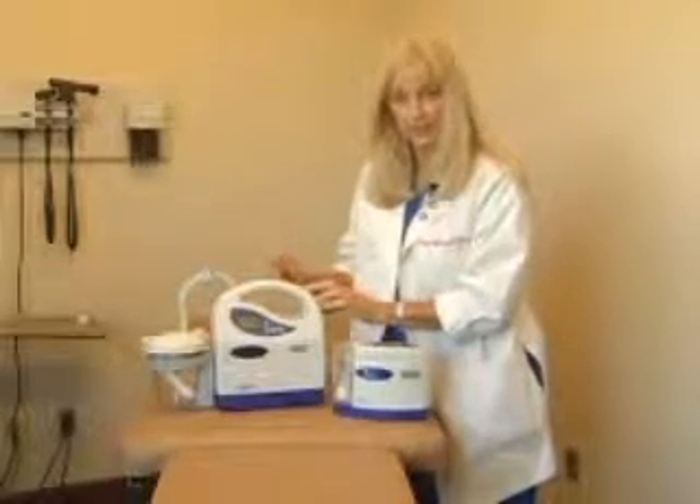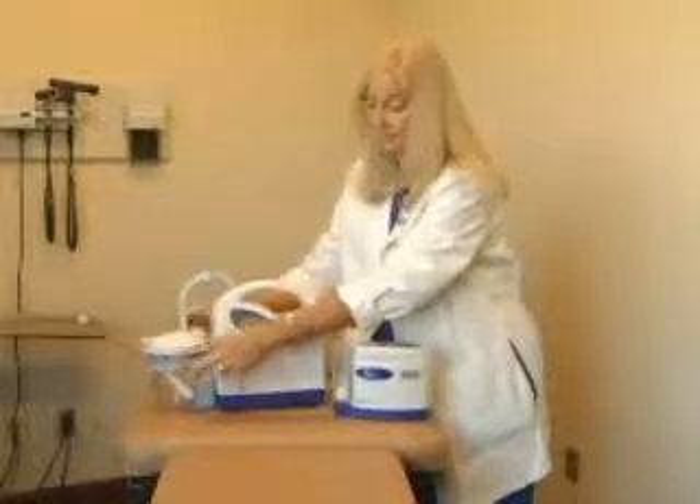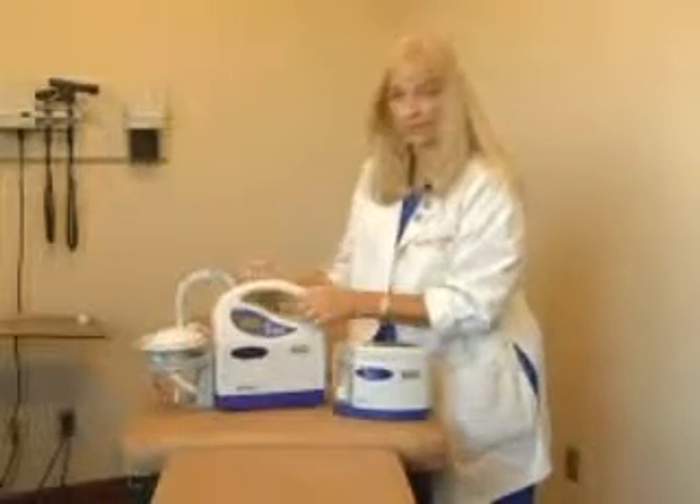This completes the assembly of the Pro 3: the gray canister ring, the canister, canister lid, and external filter.